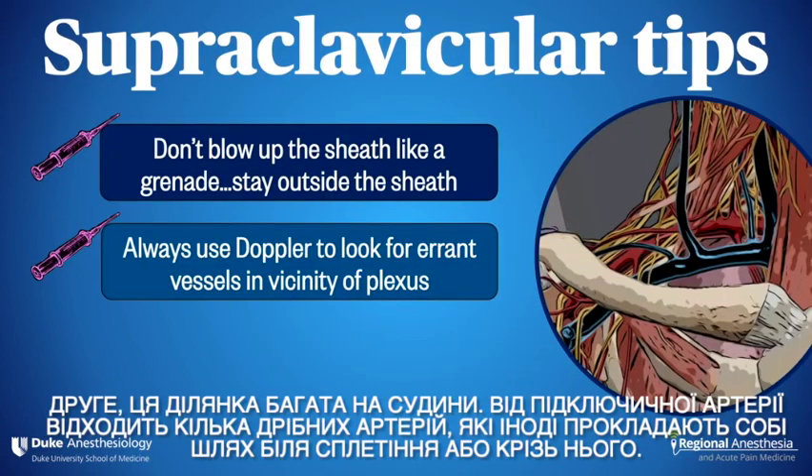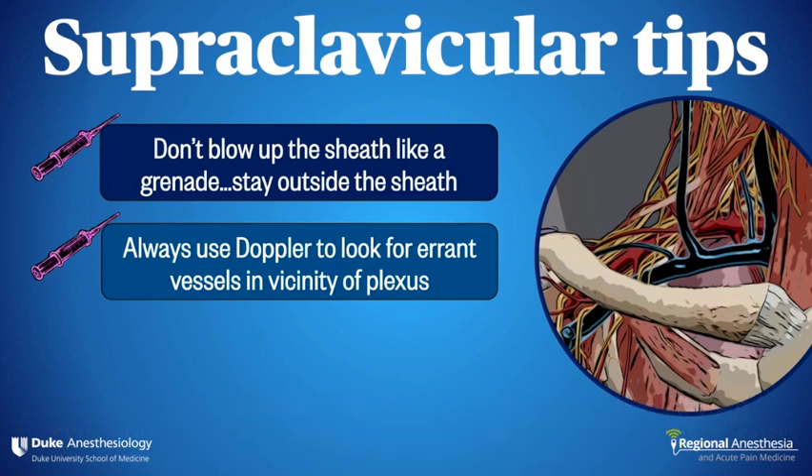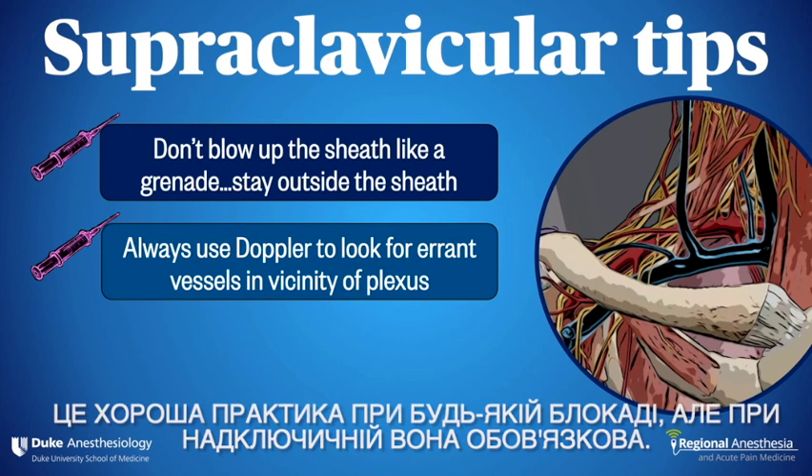Number two: this area is very vascular. There are a number of arteries that arise from the subclavian, sometimes snaking their way across or even through the plexus. Always use the Doppler function before inserting your needle. This is a good practice with any block, but a must with supraclavicular.